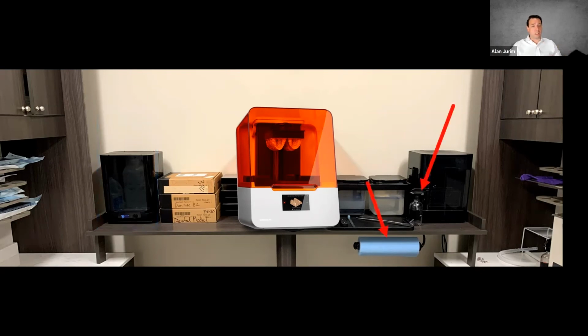Another thing that's really important is to keep paper towels and rubbing alcohol in a spray bottle close by. What I've learned is that when we didn't have the simplest tools to keep the area clean, the printers themselves would become dirtier. When the printer becomes dirty, you may have a smudge of resin on your glove, you pick up a tank, you don't realize it, and now you've transferred a little bit of resin to an area that may affect how the photo curing happens.